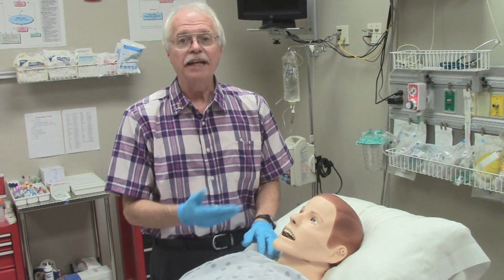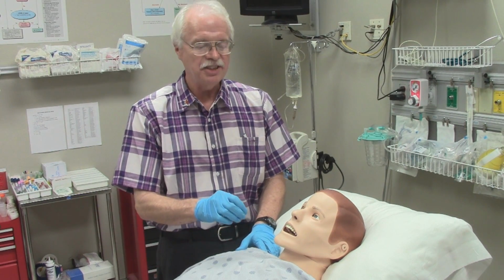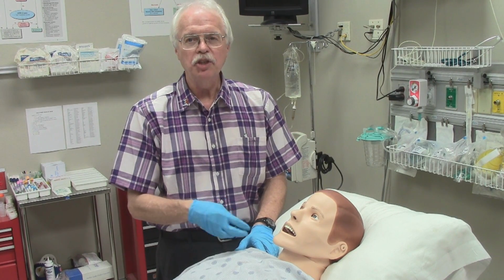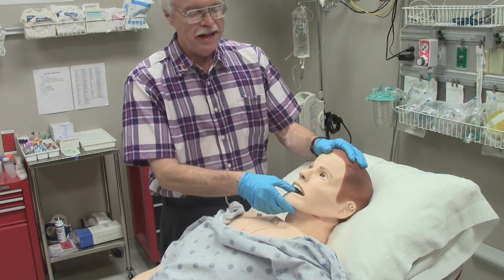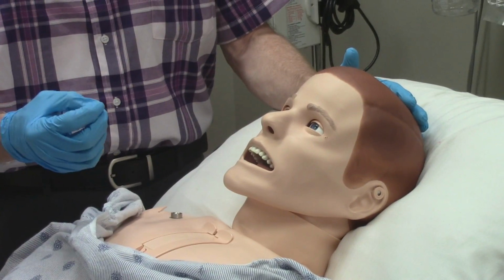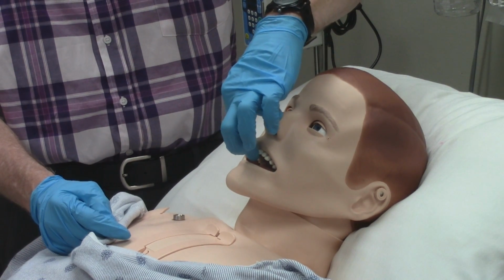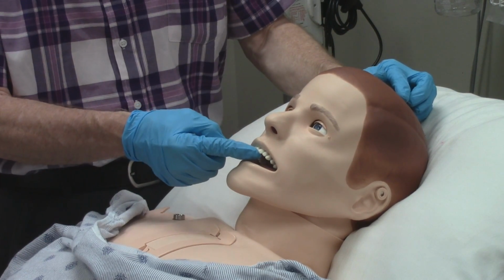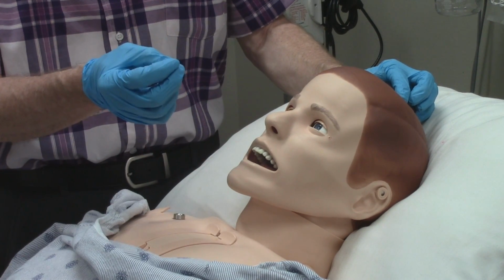The simulator has an extremely realistic airway that will accommodate invasive airway devices. It's possible to intubate the patient. It's also possible to place a combi tube or a laryngeal mask airway into the patient. When you intubate these patients, please use the same precautions you would use with actual patients. Do not pry back on the central incisors with a laryngoscope. This mannequin currently has soft teeth in that will bend if they're pried on. However, it's possible to pop these out of the jaw.